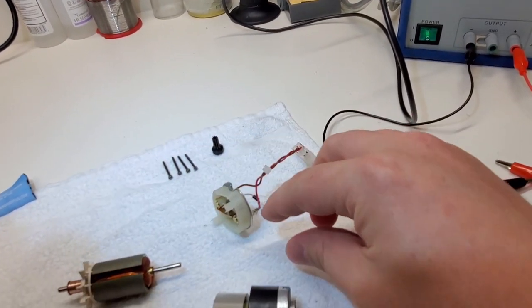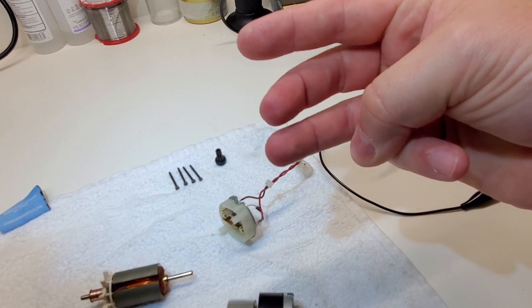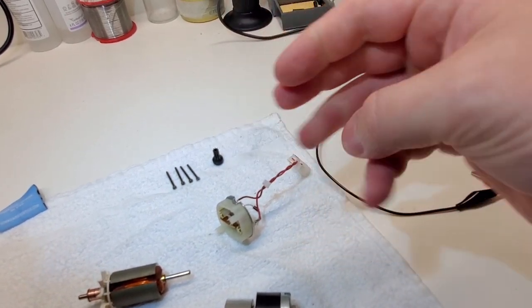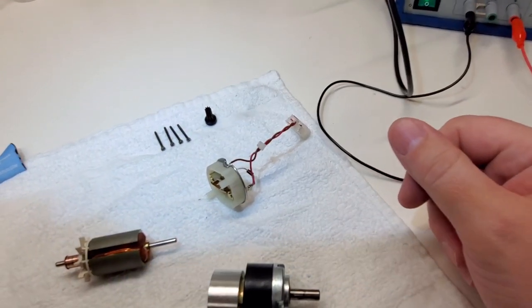The reason they do the comb type of brushes is because as it wears in, those lines will wear off and you get a lot more longevity out of your motor, basically.